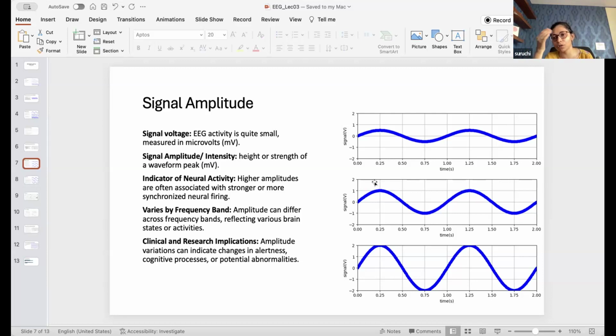In one of the papers I've seen, people have mentioned that lowest frequency has highest amplitude, and then they mentioned delta waves. Right, so delta waves have very high, huge amplitudes. That's why we plot in a log scale, and we'll see. When people plot power, power is just amplitude squared. That's what people are interested in. We want to know which frequency had how much power and how it changes as you do different things.